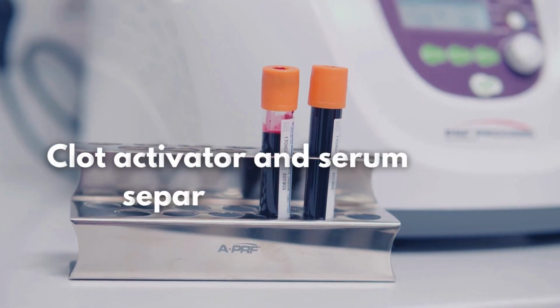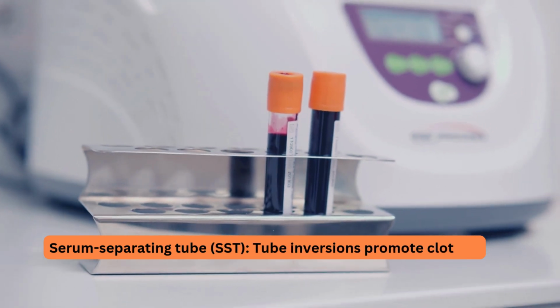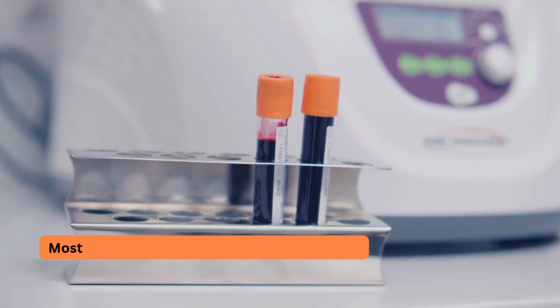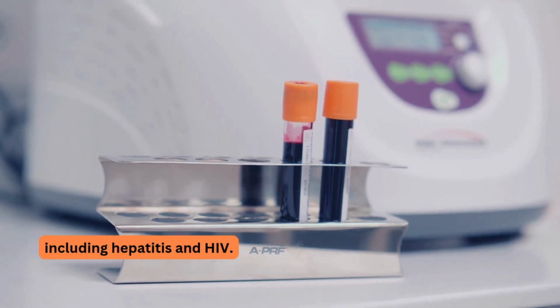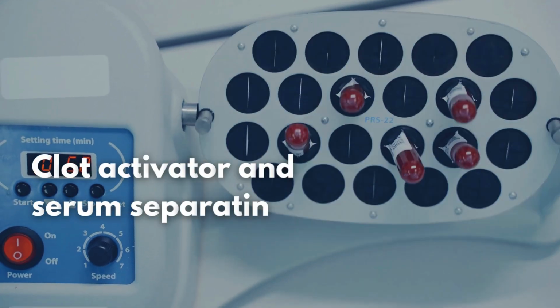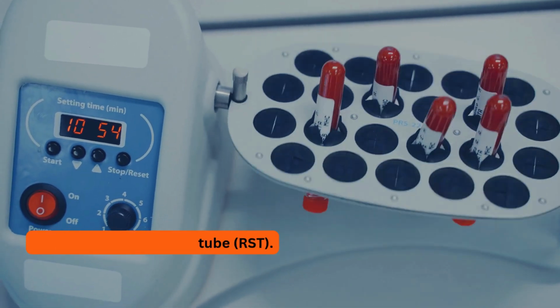Clot activator and serum separating gel additive is used for serum separating tube, SST. Tube inversions promote clotting. Used for most chemistry, endocrine, and serology tests, including hepatitis and HIV. Clot activator additive is for rapid serum separating tube, RST.